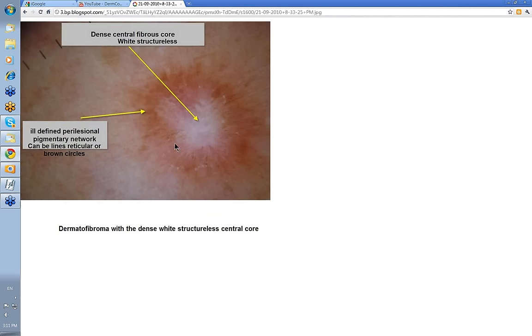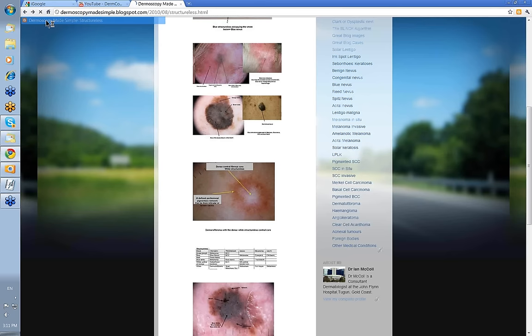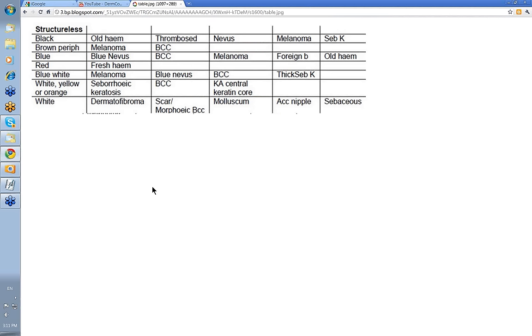Next, let's look at some of the white ones. White Structureless core — the area around it can be either reticular lines or brown circles. This is basically a dermatofibroma with a white Structureless central core. Other things can give a white Structureless core: a scar, part of a morphic BCC, molluscum contagiosum, an accessory nipple, and some sebaceous tumors can be more white than yellow. But the dermatofibroma is the one you're going to see most.